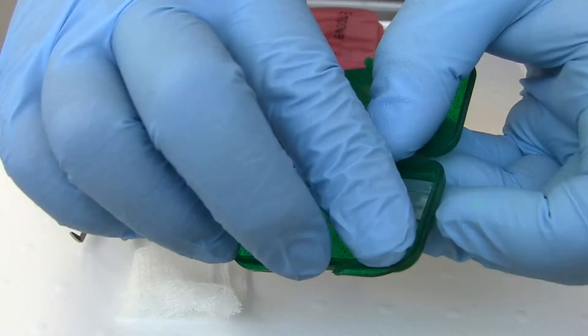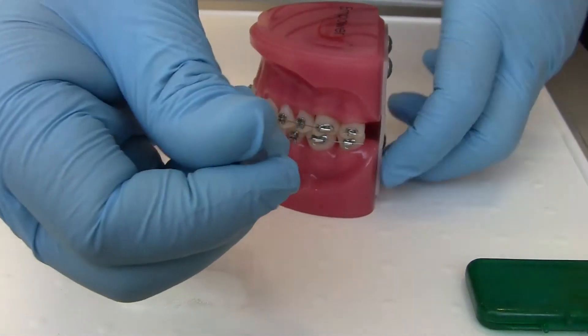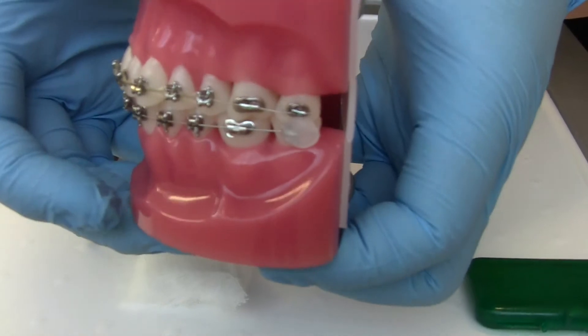Simply grab a piece of wax and roll it into a small ball, roughly around a pea size, and then you can put it on top of the bracket where the wire is poking to temporarily relieve discomfort. Please refer to how to use wax at home for more details.